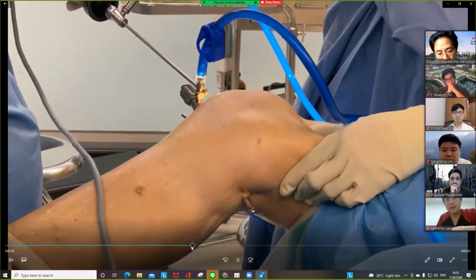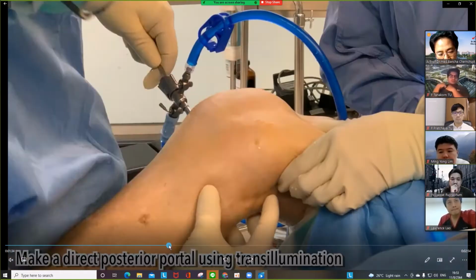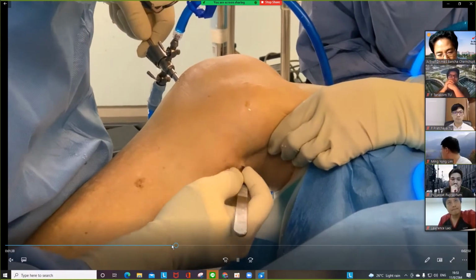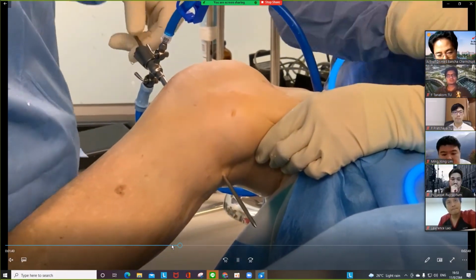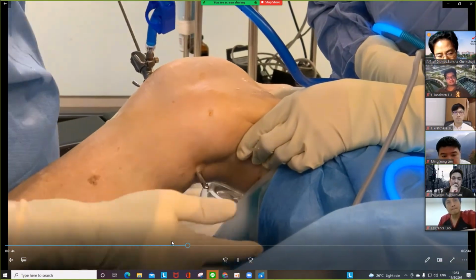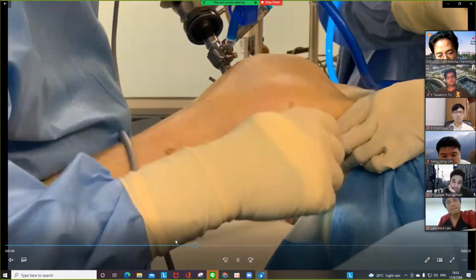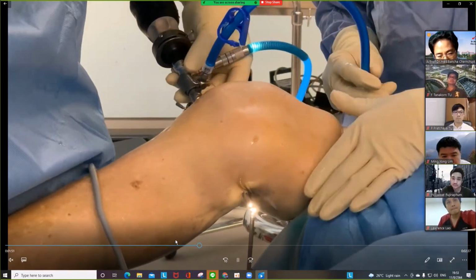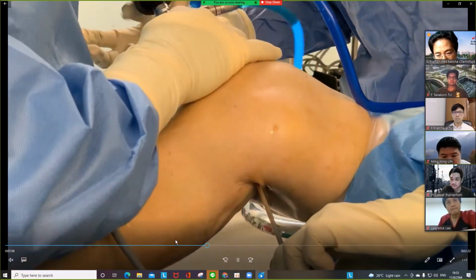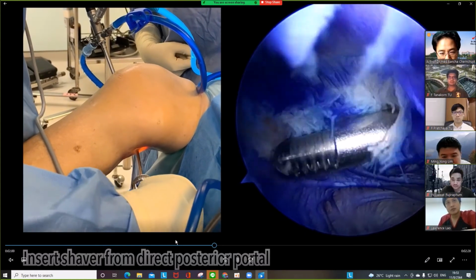Can you see well? I repeat again. Okay. Careful, your knife should be just tap incisions and then you dilate, okay? Front to back. And then follow with the shaver. But very careful at this step. You should not move your knee because otherwise your cannula can be broken, right?